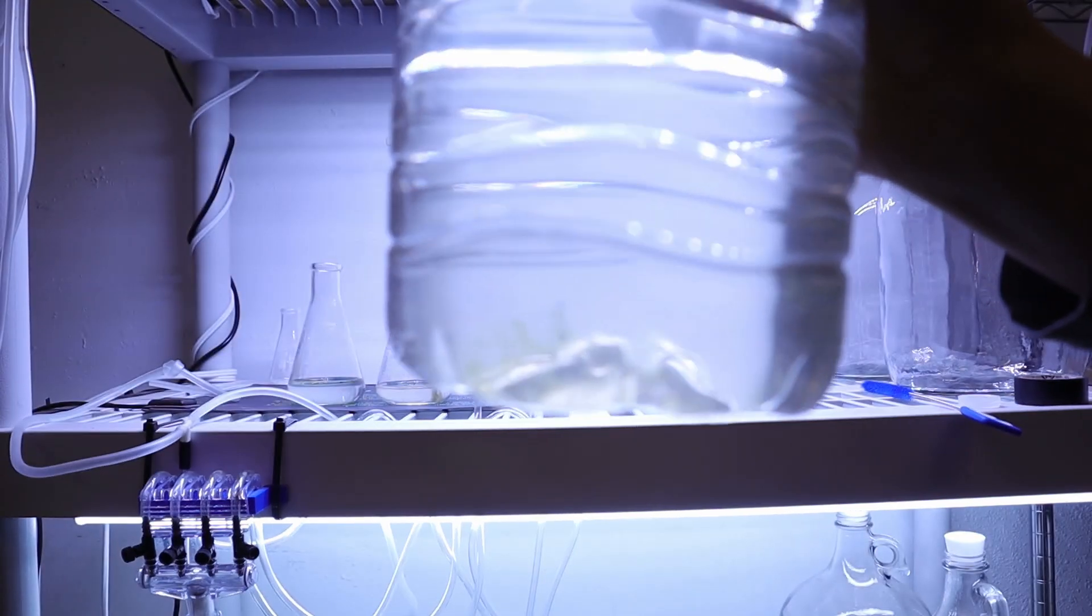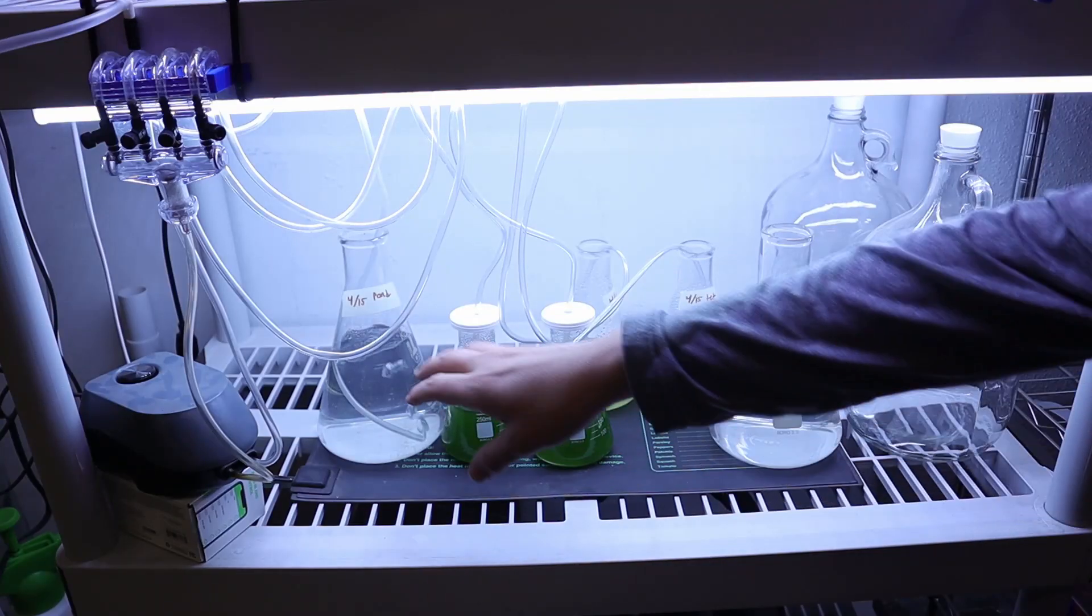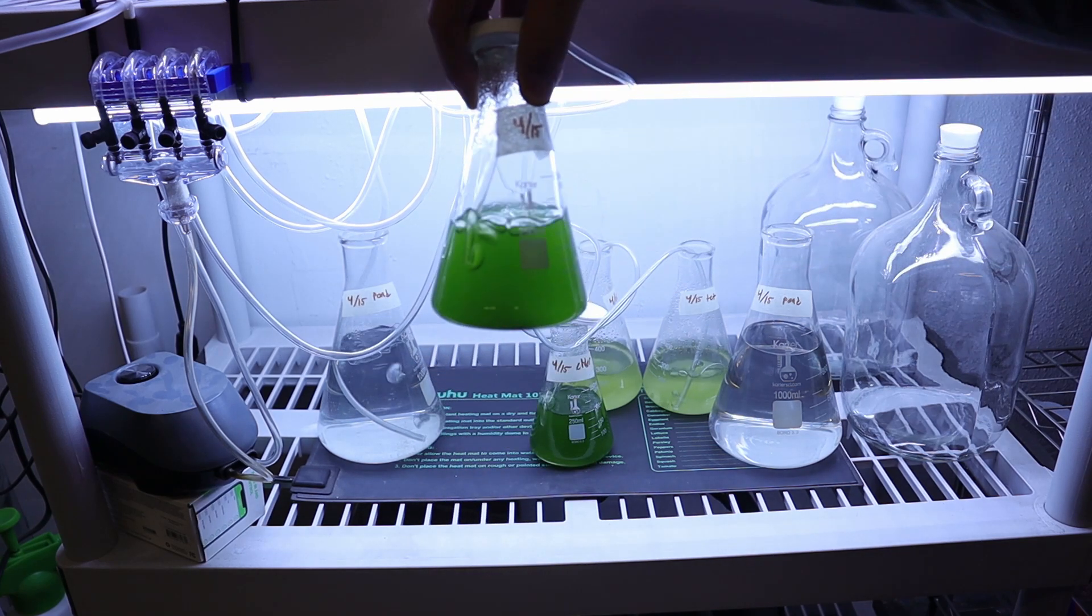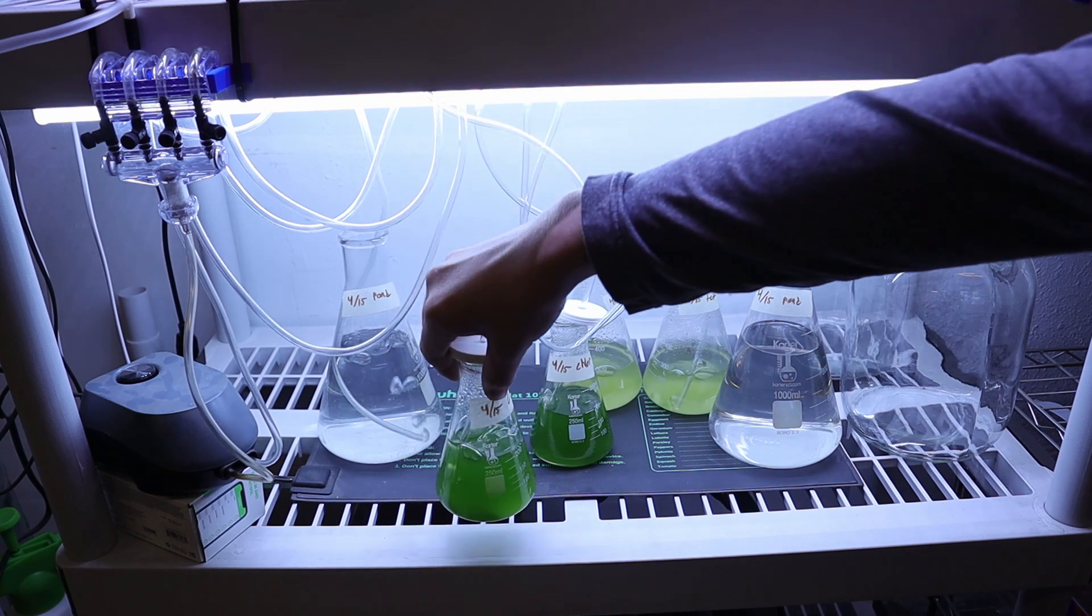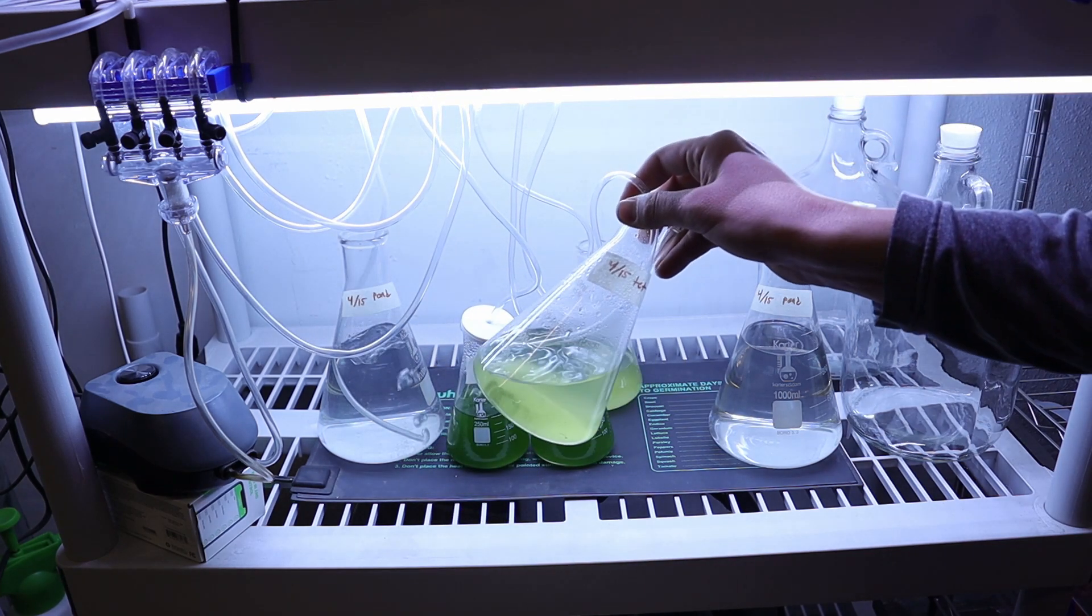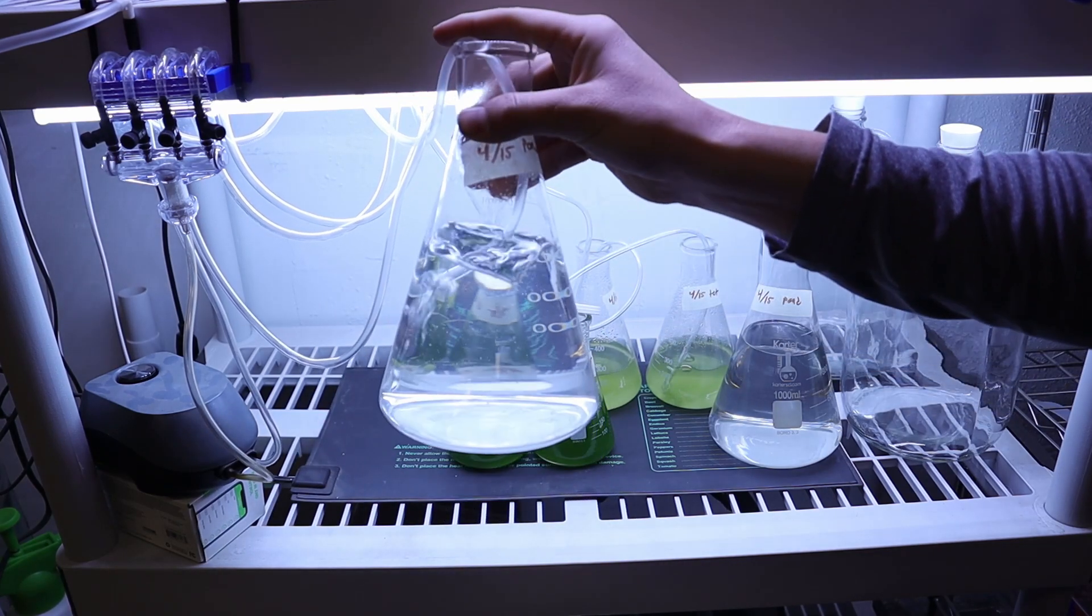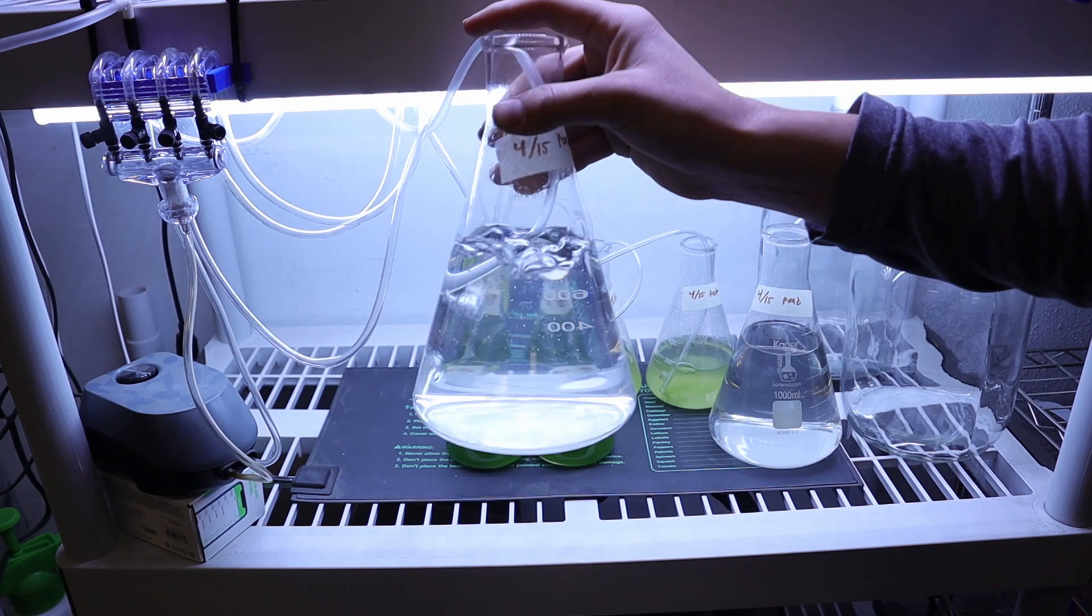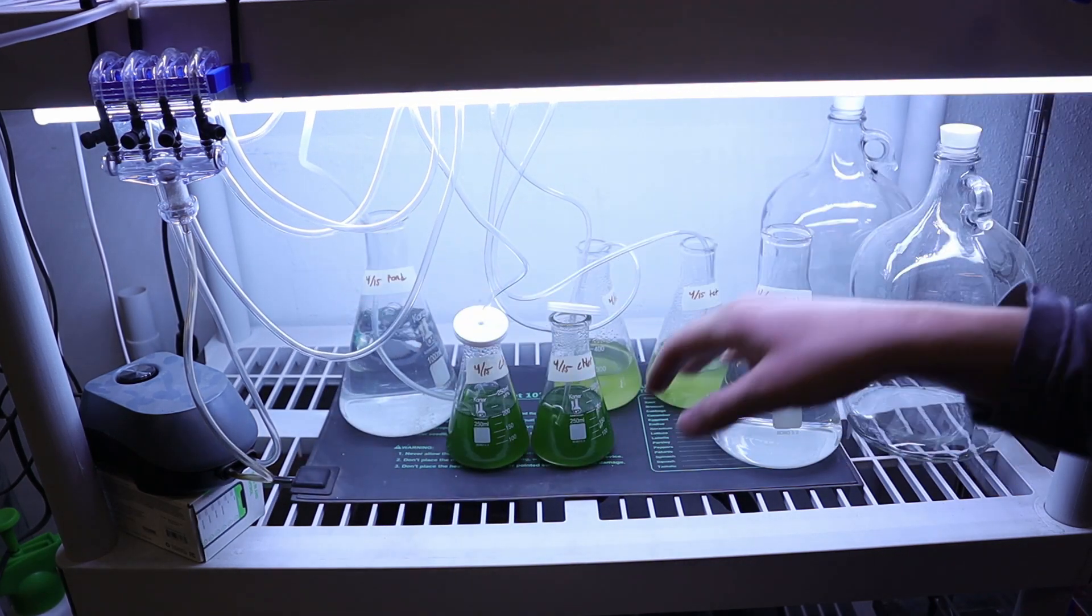So everything down here is also looking fantastic. You can see some nice green in there from the chlorella. The tetrasillamus has got some good growth going on down in there, and we're starting to get a little bit of growth in the pond water. It's hard to tell because it's so clear, but a little bit of growth in the pond water.